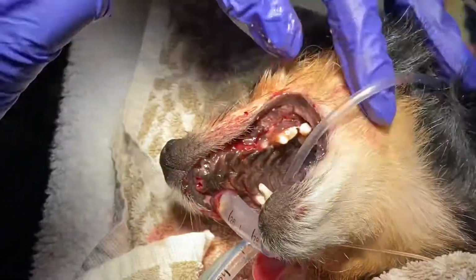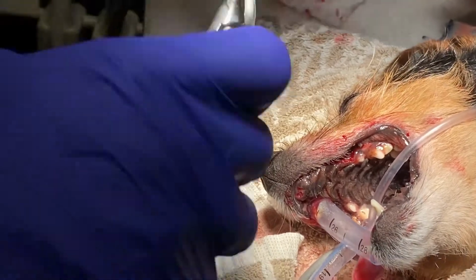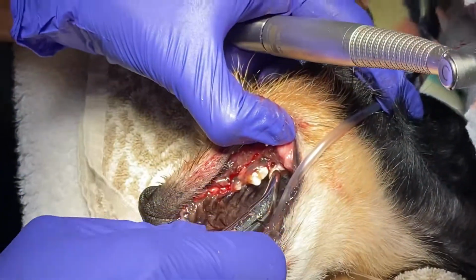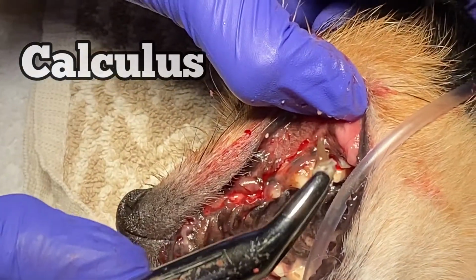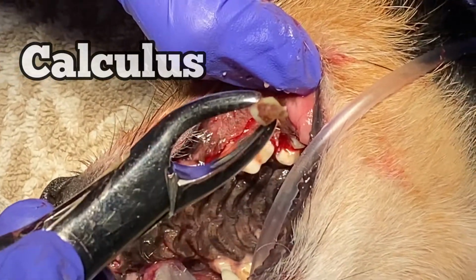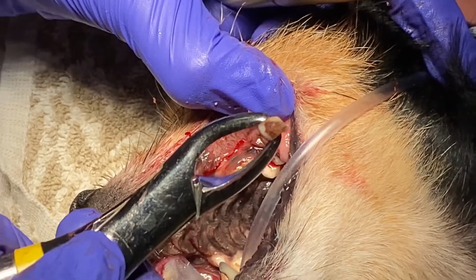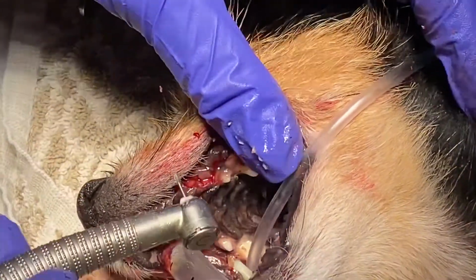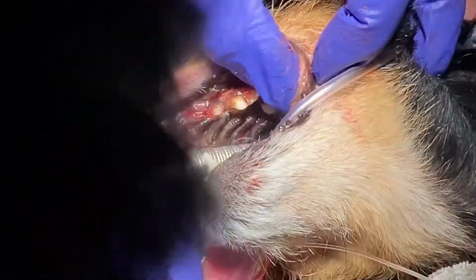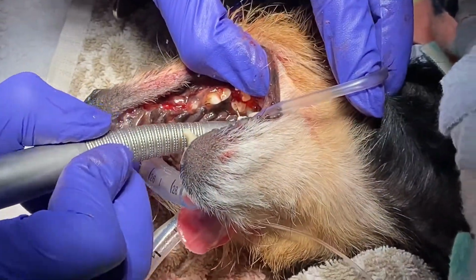This tooth is so diseased that the roots are basically just falling right out of it. See that? Can you see the amount of calculus? It's all the way down to the root of that tooth. That should not be that way, ever. There's so much bone loss and so much bacteria that built up on the surface of that tooth. And this will come out in 3, you said? 3 pieces.